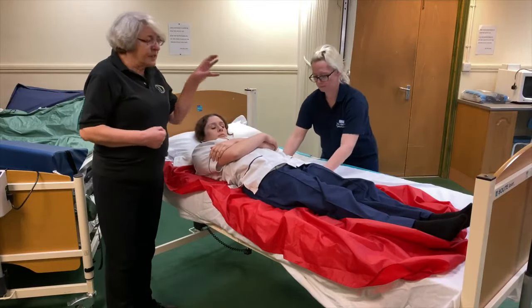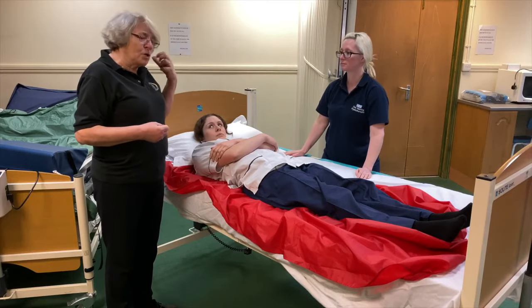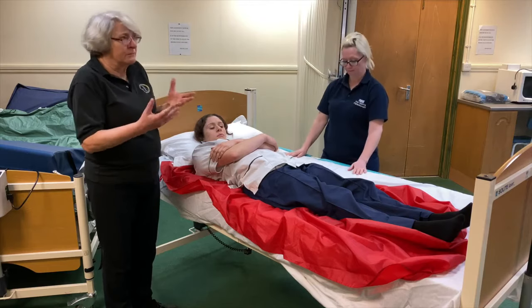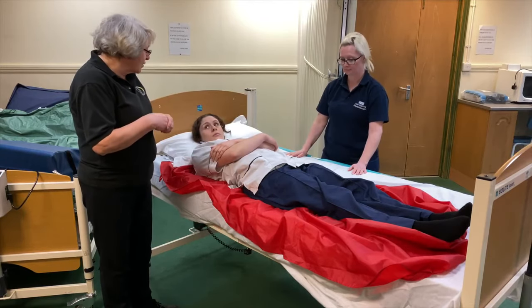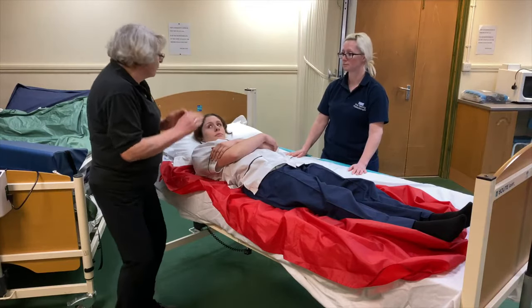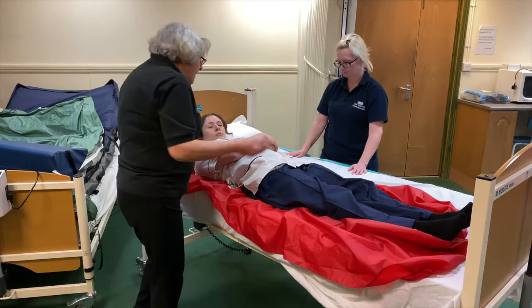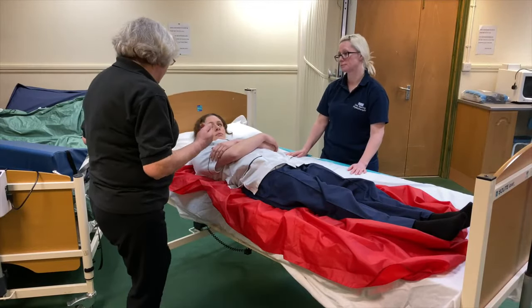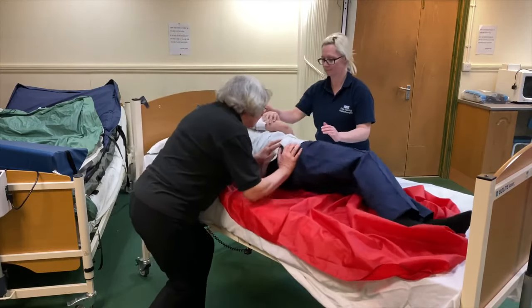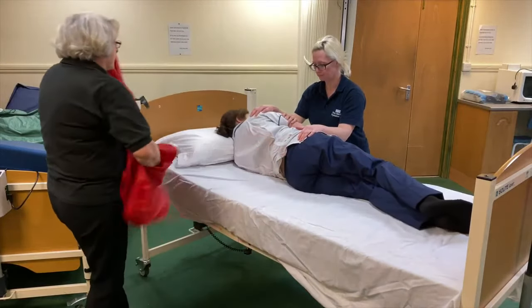Now this time, because she's much more on my side of the bed, Lisa is only going to be there ready to be the stop, or to make sure that she is comfortable on the other side. Or we would put the bed rail up. We would have a barrier on that other side of the bed. When I say ready, look towards Lisa, and I'm just going to roll you onto your side. Okay, you're ready, and roll. I can now peel this out very comfortably.